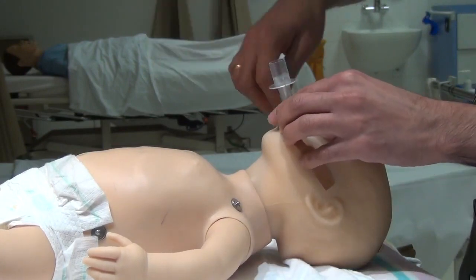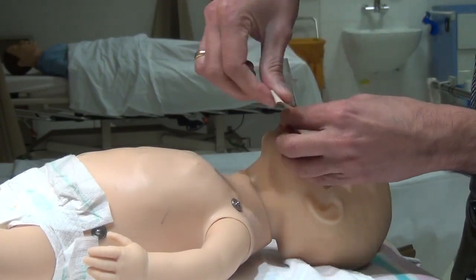The iGel should be fixed in the midline, taped down from maxilla to maxilla.